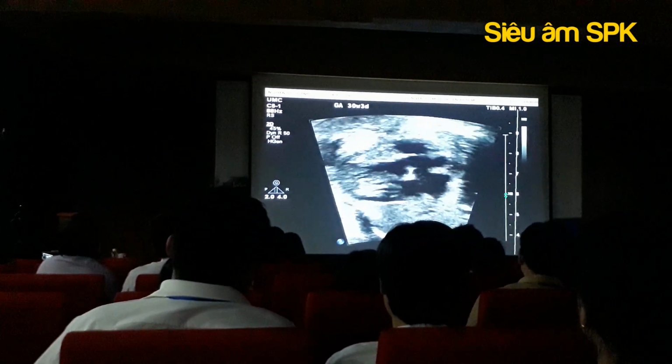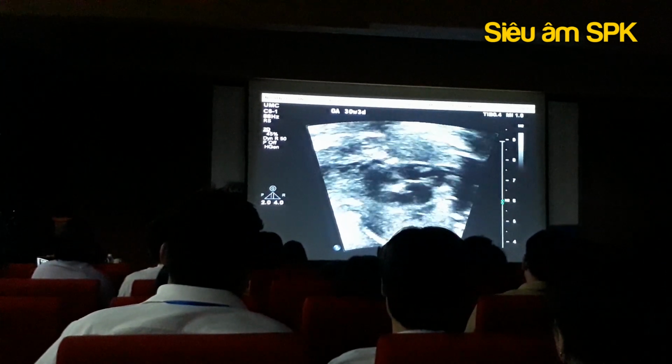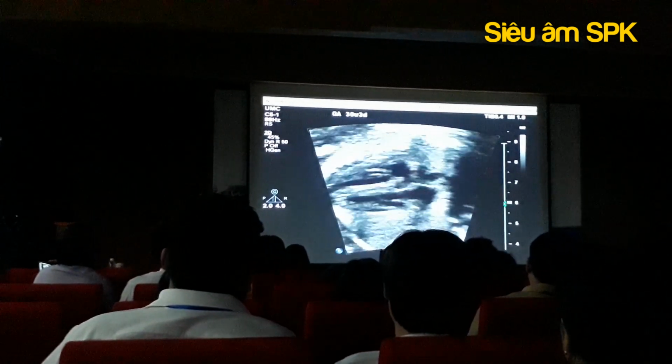Như vậy có thể chúng ta thấy hầu như là khi xuất phát nó nằm ở phía bên phải hết, cho nên khả năng nó sẽ là cái đường thấp phải hay đường thoát.